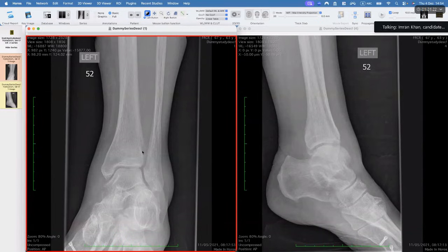I'm not saying it's the easiest X-ray to be done, but it is there. So she came in, she was in a lot of pain. She was literally not able to bear weight. And I looked at her and I said, this does not feel right. Looked at the X-ray and I was worried about something else.